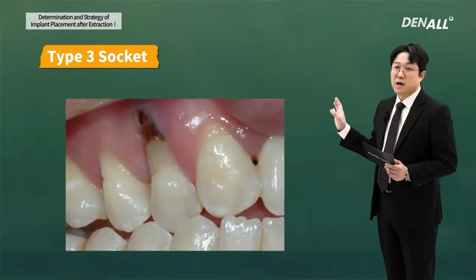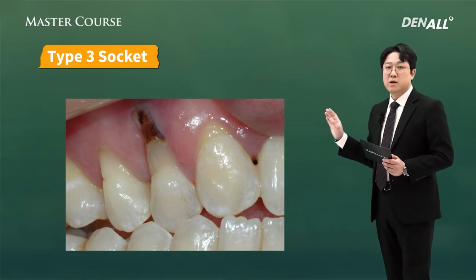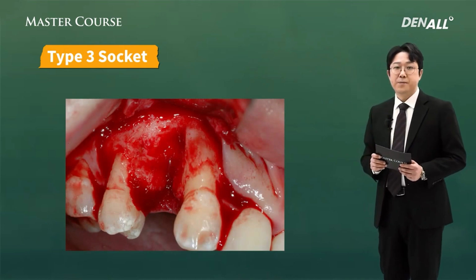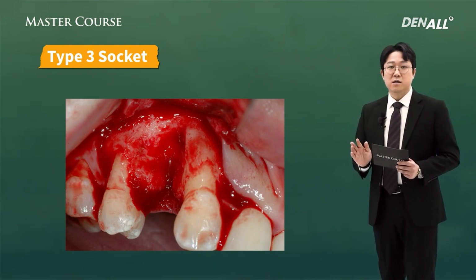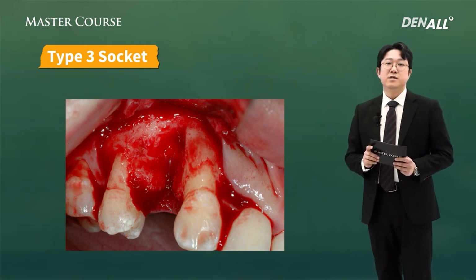In number 14, there's soft tissue resorption buccally. When I open the flap, there's also bone resorption. So I'm going to complete my explanation about extraction socket. I'm going to talk about the treatment strategy for each case in the next lecture as we look at clinical cases.